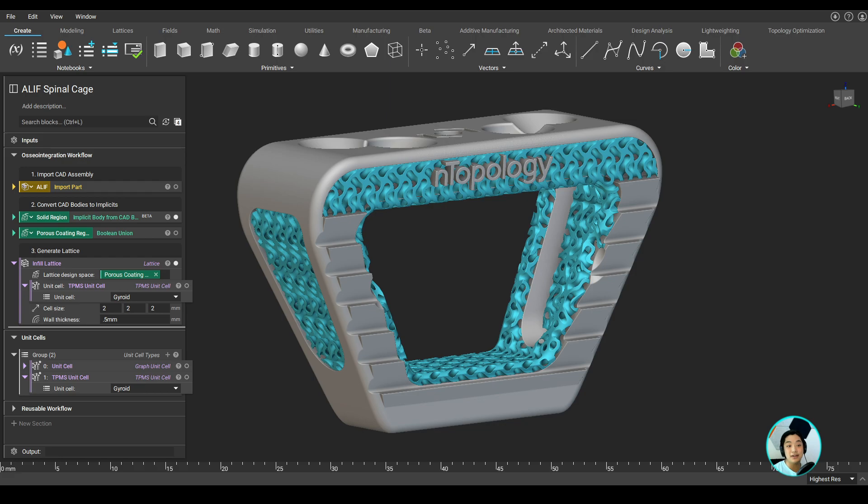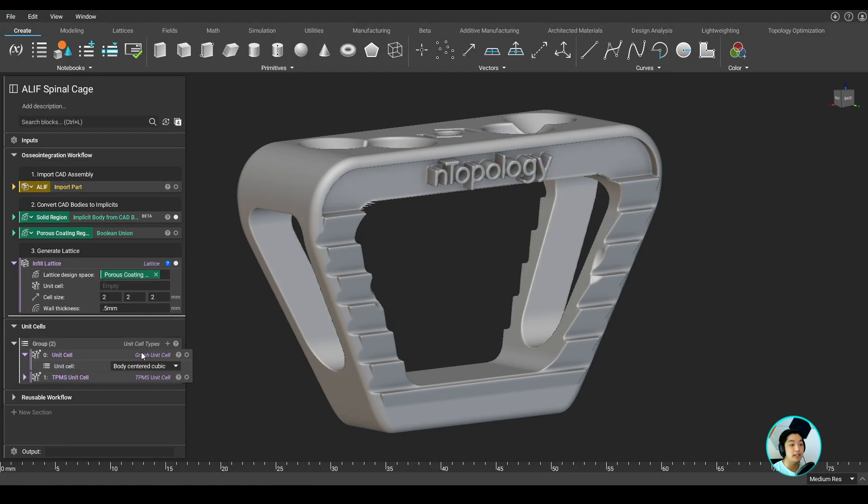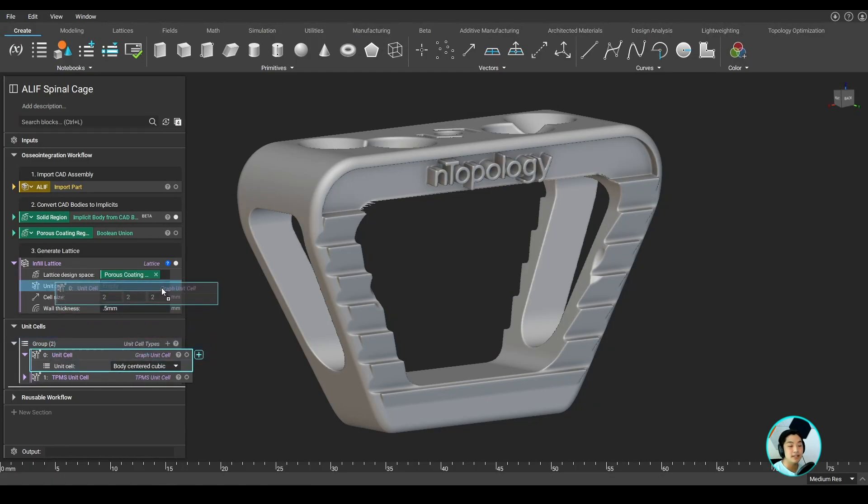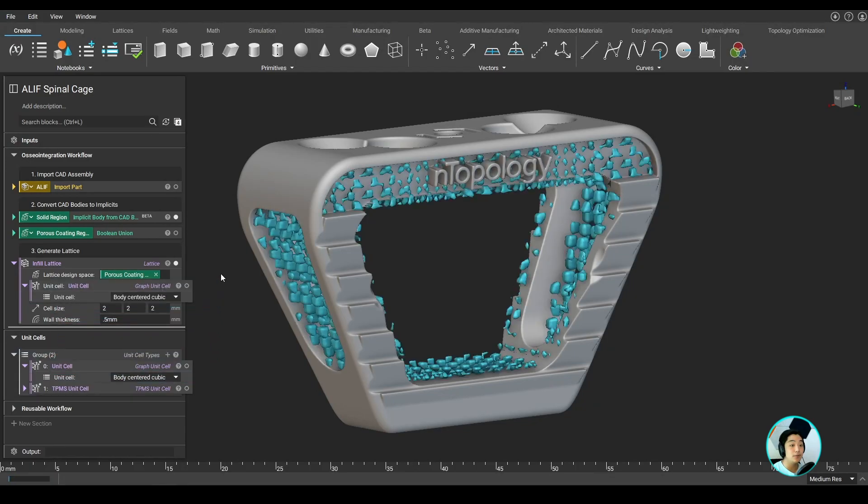For example, if the unit cell is something I am looking to adjust, I can take out the gyroid unit cell and bring in something like a body-centered cubic lattice unit cell, and the workflow will seamlessly regenerate.